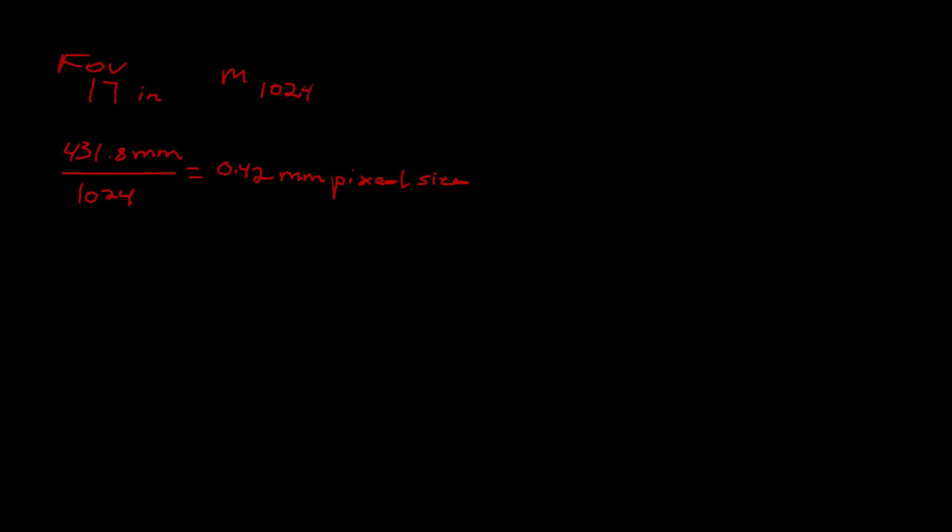Okay, so for the field of view, it is 17 inches. We converted that to millimeters, which is 431.8 millimeters. The matrix size is 1024. We divided 431.8 millimeters by 1024, and that equaled 0.42 millimeter pixel size.